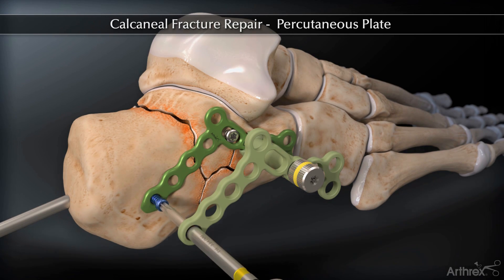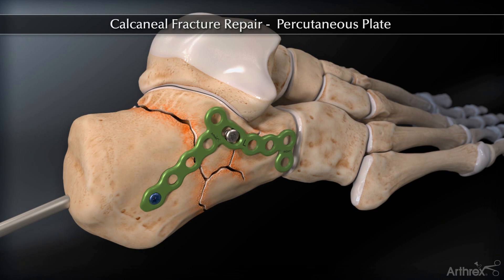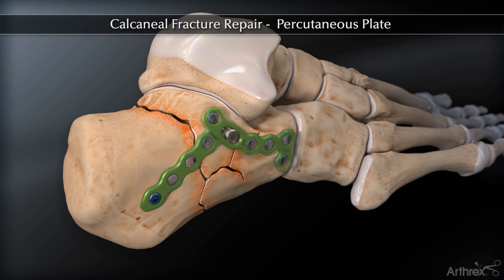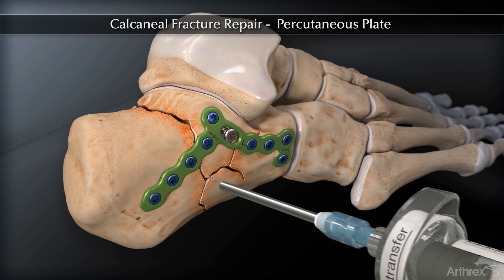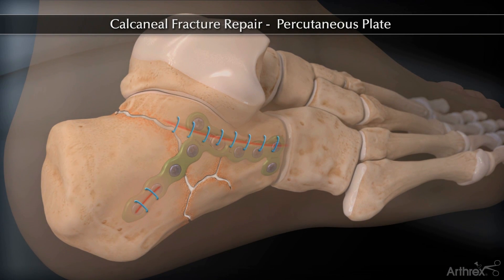The plate may be contoured in situ using the bending guides or locking drill guides. Remove the Shanz pin and fill the appropriate holes. Insert Quickset to fill the void. Fixation complete.